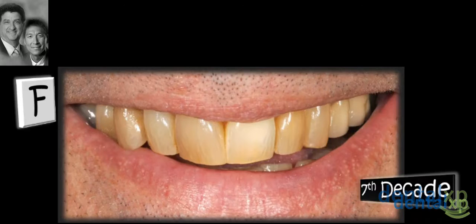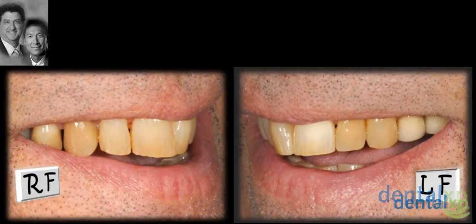But if you look from the lateral views, the right frontal and left frontal view, you could clearly see that even the patient has a little bit of interdental recession, but the papilla is still visible. So don't get fooled that it's just the midfacial. It's really about the interdental. That's the most important piece to this.